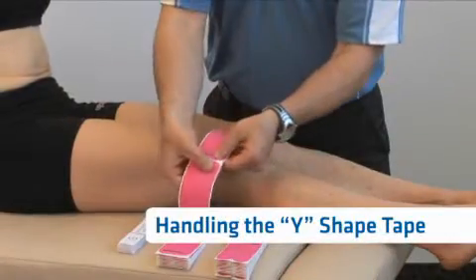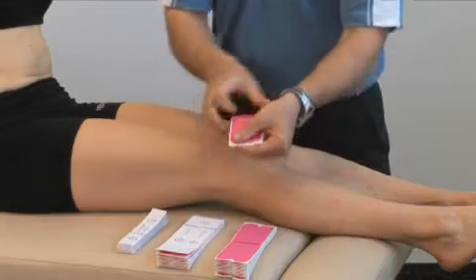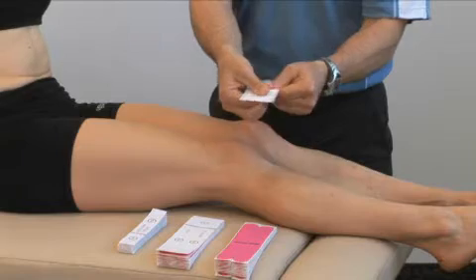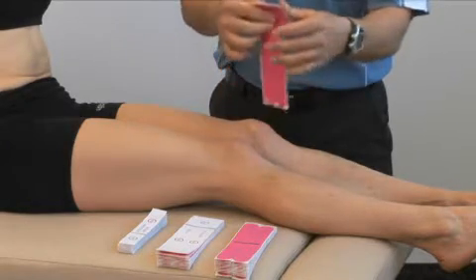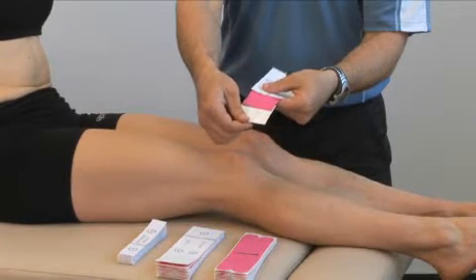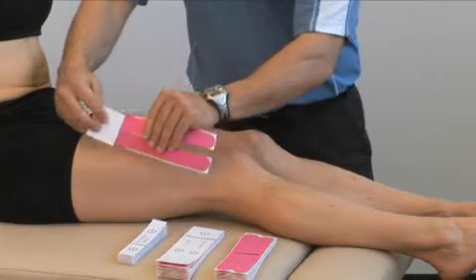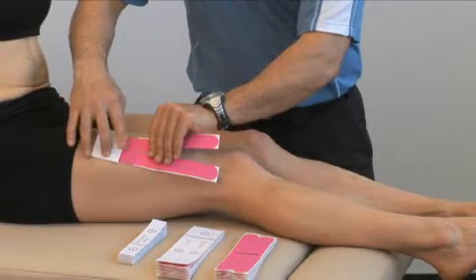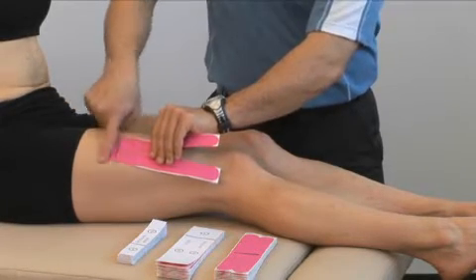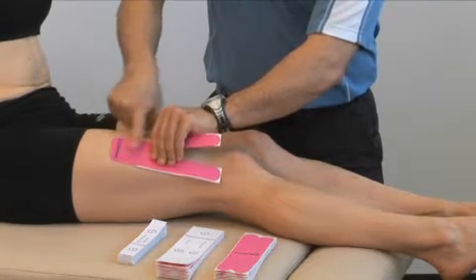For the Y-strip, remove the Y-strip away from the other ones, turn it over, tear along the black lines. Gently remove part of the backing of section one to expose the tape without touching the adhesive, lay over top of the area that you want to apply, then remove the backing completely, gently lay the tape down, and then rub over top to activate the glue.